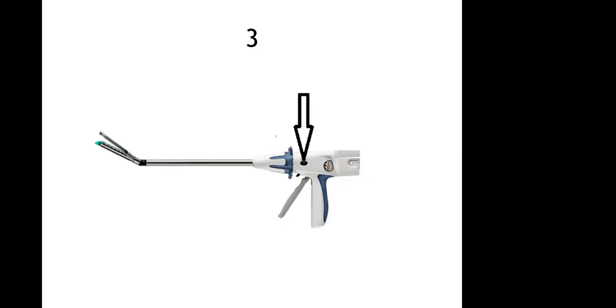You cannot use this stapler instrument for a choledochojejunostomy. It has to be the gastrointestinal tract, not the hepatobiliary system. You may have seen this being used for gastrojejunostomy, jejunostomy, or ileotransverse anastomosis following right hemicolectomy.